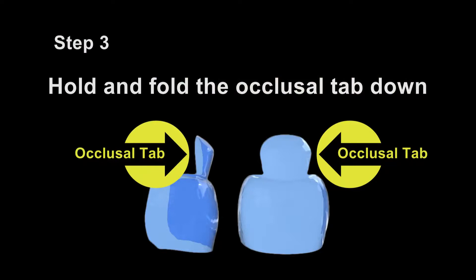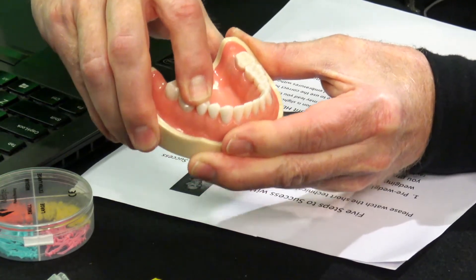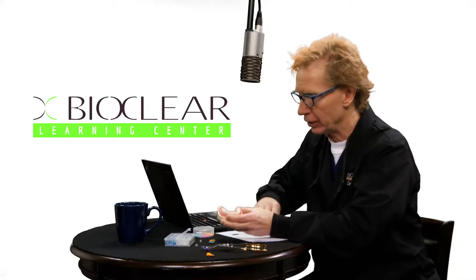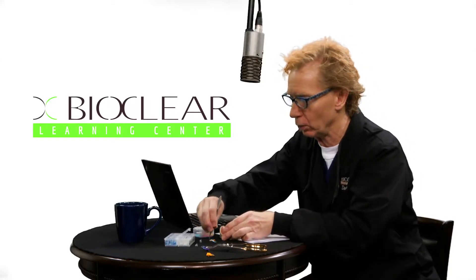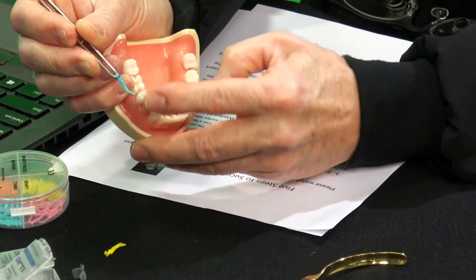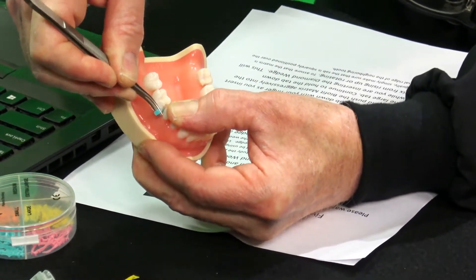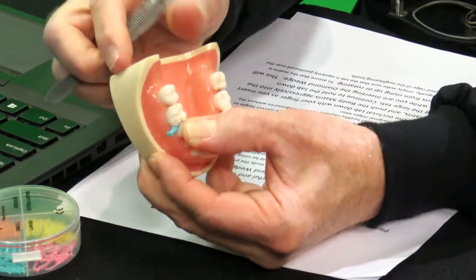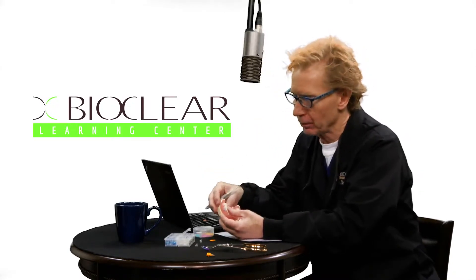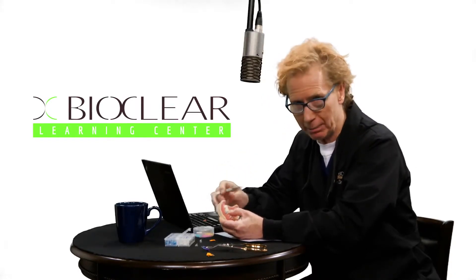Step three: hold and fold the occlusal tab of the BioFit matrix. Once you've inserted the matrix, you want to take that little tab and press it down very aggressively against the neighboring tooth. That's going to bend the tab down, and you want to put good pressure here to drive it as far apically as you can. As you reinsert the wedge, make sure and press the tab down with your other finger — I'll use my thumb here for demonstration. Keep pressing the tab down and drive the wedge interproximally, and give it a push. You want to always hold the tab down because if you don't, the matrix can slide lingually or buccally. It also can rise up. If you just hold the tab down — and we put this big fat tab on there so you can put your thumb or finger on it — it will help that matrix stay right where you want it.